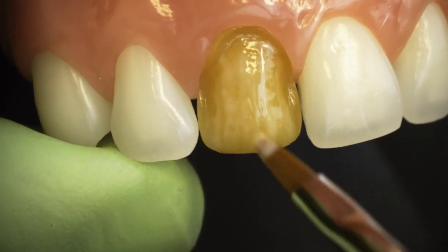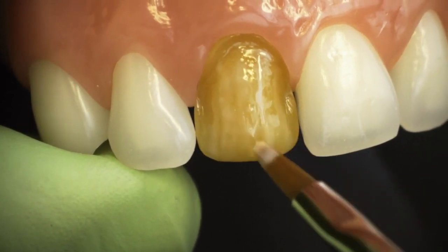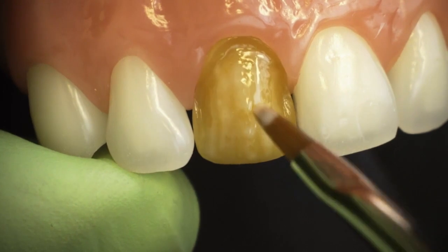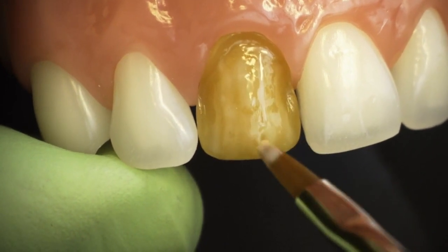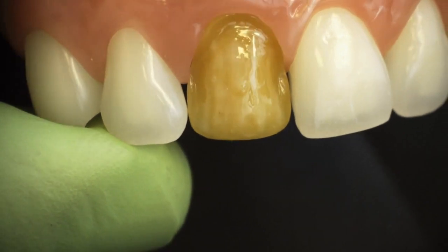I'm going to be spreading my pink opaker. You can see there are a couple of little bubbles, so I want to eliminate those bubbles. Once I have a thin layer, I'll be ready to cure that for 10 seconds.